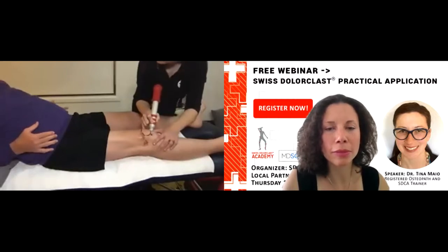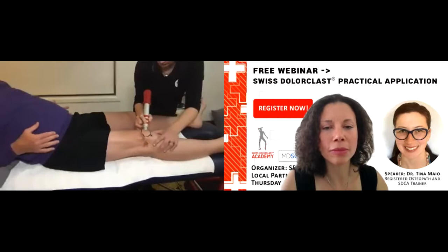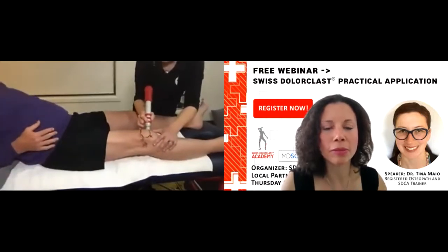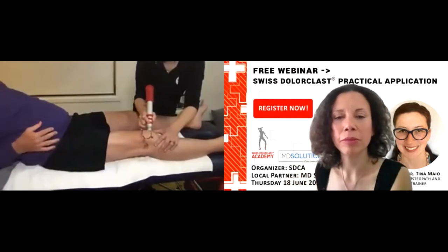Out of 10, how's that? Yeah, that was up there. So playing with the direction of your shockwave is also helpful. Breathe, breathe, breathe. Okay, so let me know when that starts to ease.